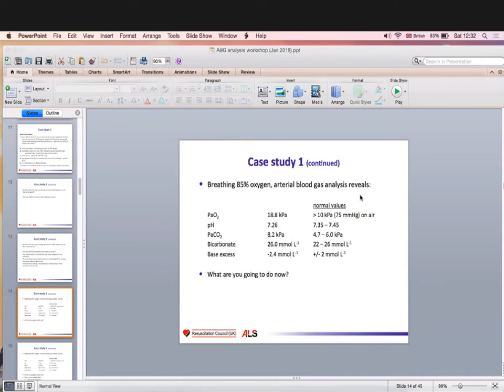First question, how is the patient? Okay, first question is how is the patient? How is the patient's condition? Okay. Then oxygenation. What can you tell about the oxygenation?